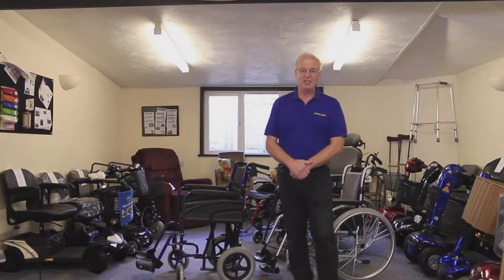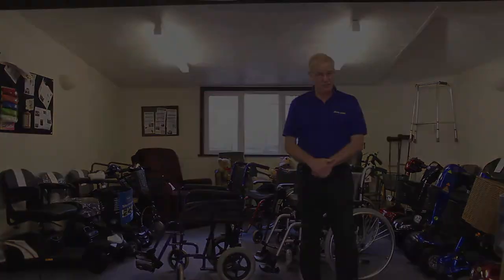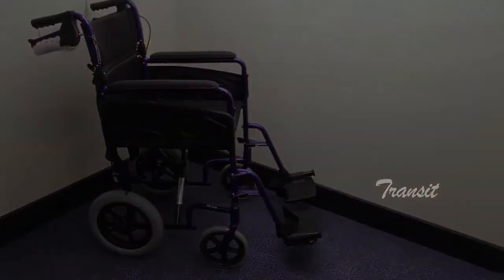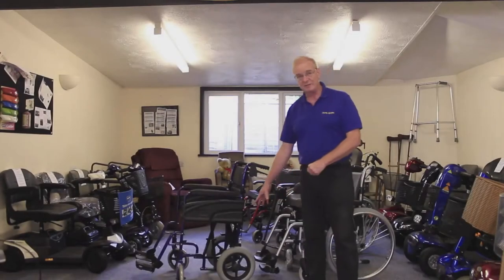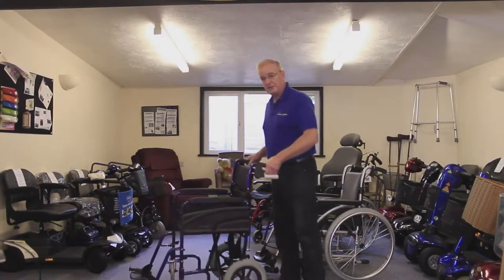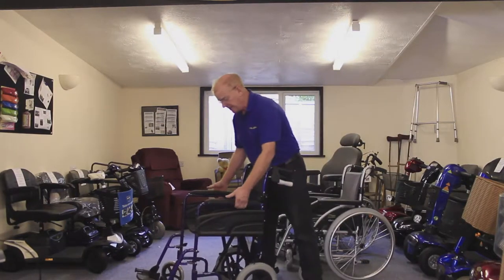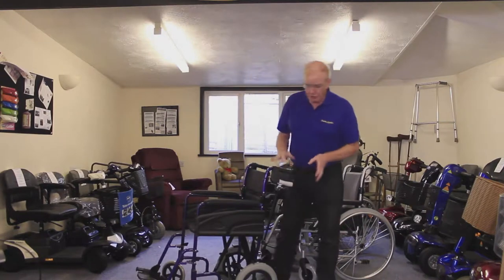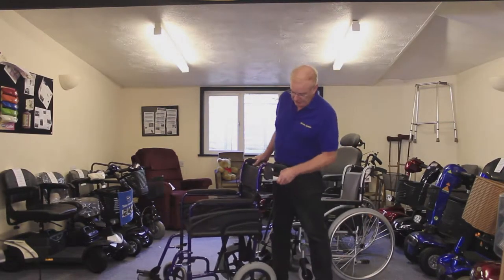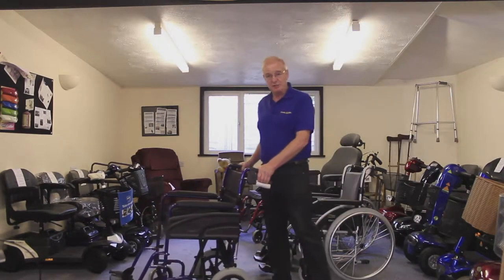Manual wheelchairs divide into four main types. The first type is the transit chair. This is a chair with small wheels at the back, designed to be pushed rather than for the person in it to push. This particular chair is lightweight, not particularly smart looking but adequate enough. One important feature is it has brakes that are operated by the person who is actually pushing you.